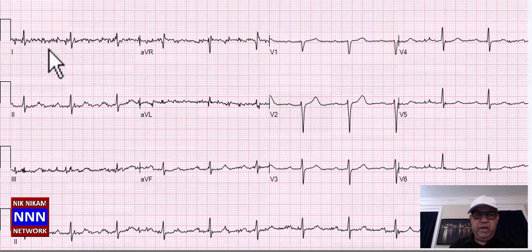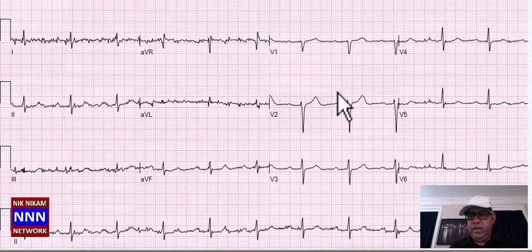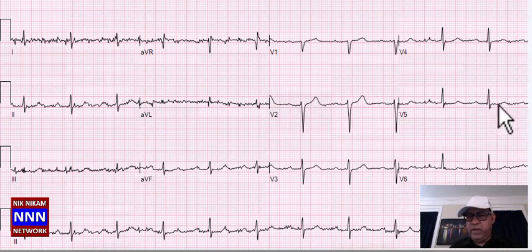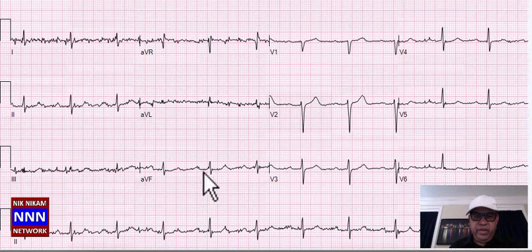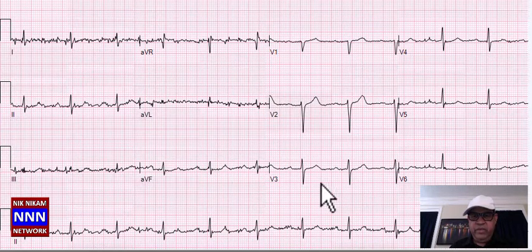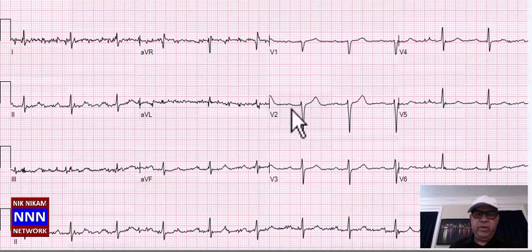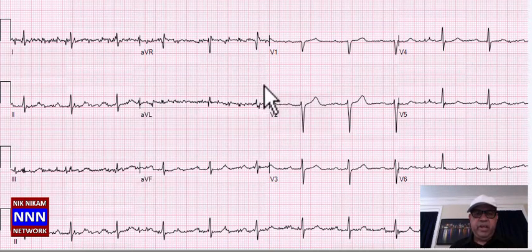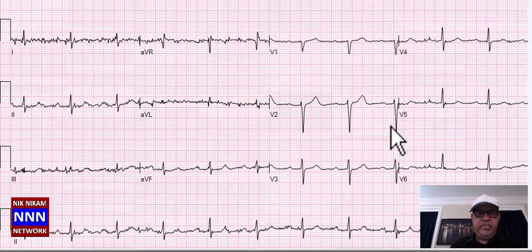We have baseline artifact here. I see a nice P-wave here, another P-wave — P-wave QRS complex — so this is sinus rhythm with baseline artifacts. T-waves are just flat, non-specific ST-T changes.